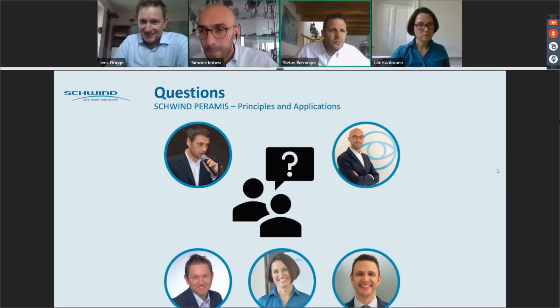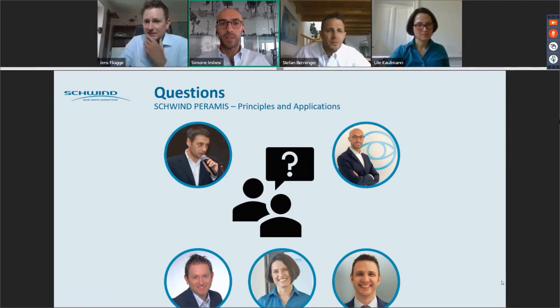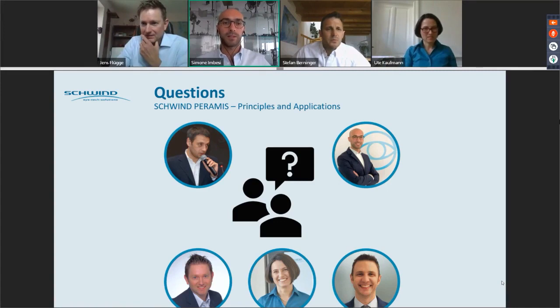Okay, the question is, with a keratoconic cornea, is the topography reliable if the corneal apex is decentered and measurement aligned with apex? I would say yes. We have even a map that helps us to describe better the shape of keratoconus. This map was not commented in my presentation. I'm talking about the Gaussian curvature of the cornea.